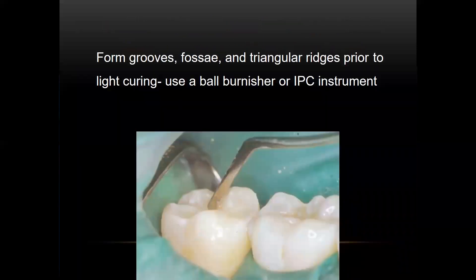We etch, wash, dry, apply bonding agent, light cure, and then build it up with composite. This is a little micro brush which is readily available and works really well for compressing composite into a tooth.